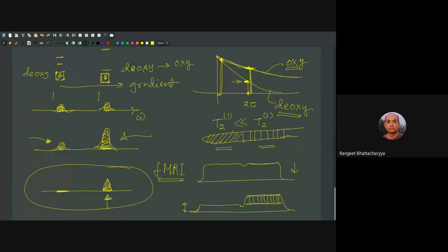Now the functional aspect, meaning how do you record the control and how do you record the actual one. So what you do is, there are two things. Control means, does it require a person not doing anything, a truly flat brain response? That is extremely difficult. It's extremely difficult even when we sleep. Something is going on, and it's nearly impossible to make sure that a person is not thinking anything.